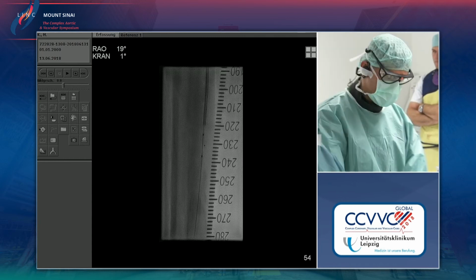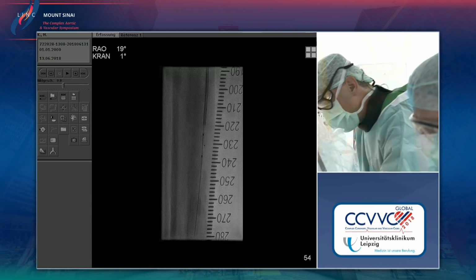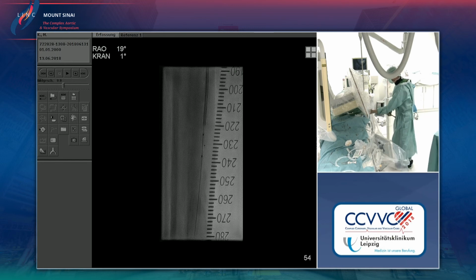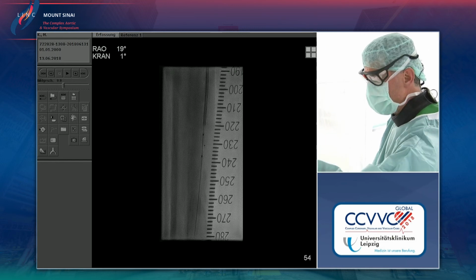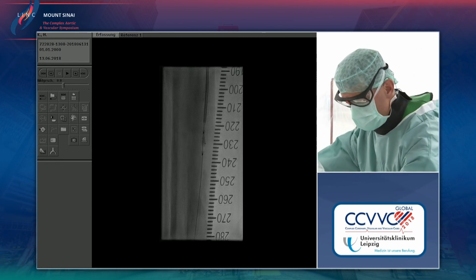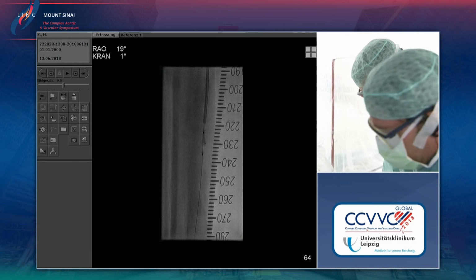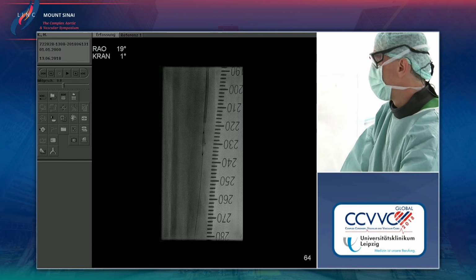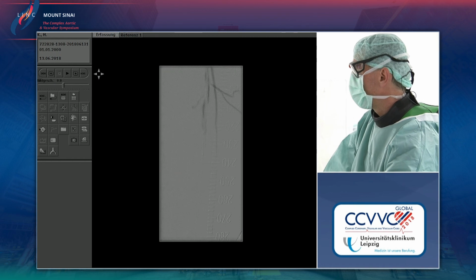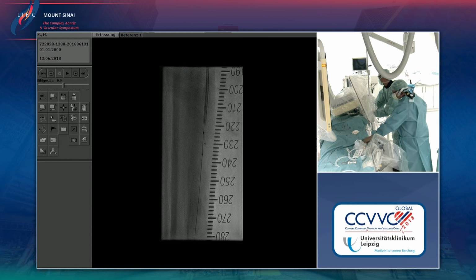Because I think we're all looking forward to seeing the results. Well, actually, I'm not completely informed of how far we are, but I think we did 2/3 of the patients here in Europe. I know that the trial with George Adams has completed inclusion, atherectomy plus DEXA versus atherectomy only. Here it's balloon. We were not as fast as he, so we still have to wait for the results.